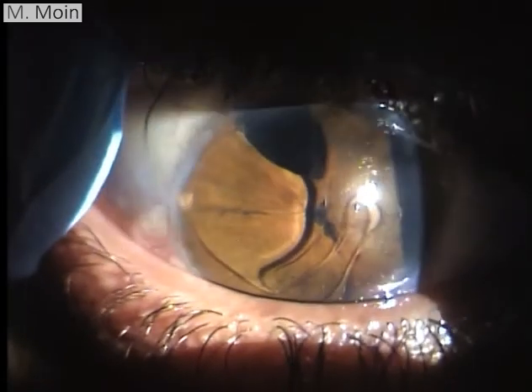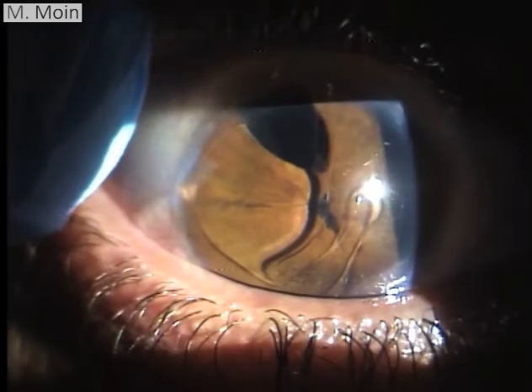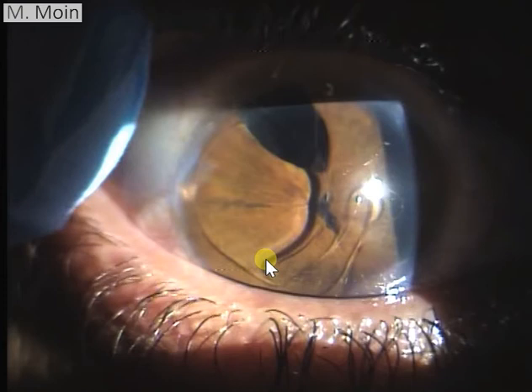Welcome to this anterior segment video in which I'm going to show you a very interesting case. This is a patient who has something in the anterior chamber. So let's start drawing and see what we have.